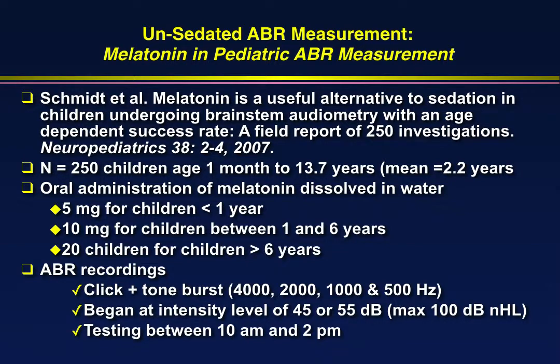And then give the child about 15 to 30 minutes to fall asleep. The lights have to be out totally, it has to be totally black, very, very dark. And then the children fall asleep. In this study, the authors found that more than 80% of the children fell asleep long enough to perform a complete, adequate ABR.